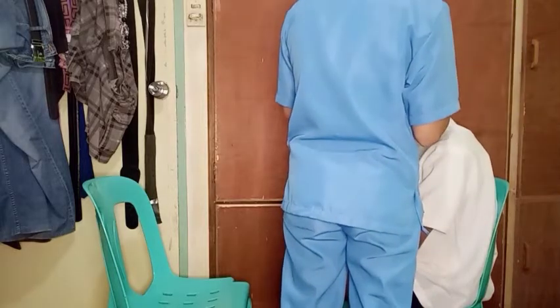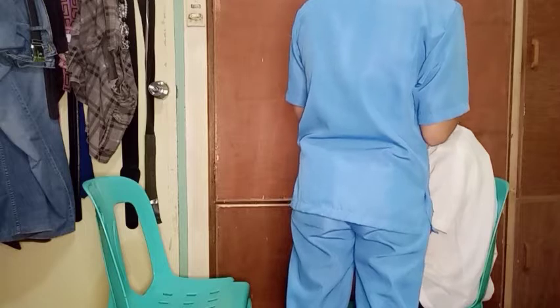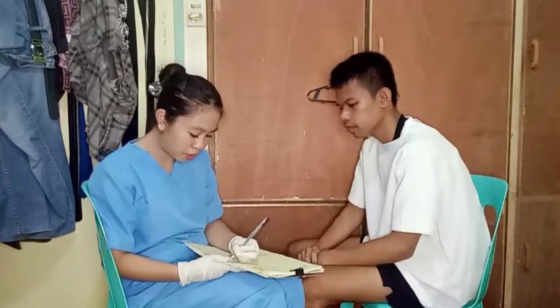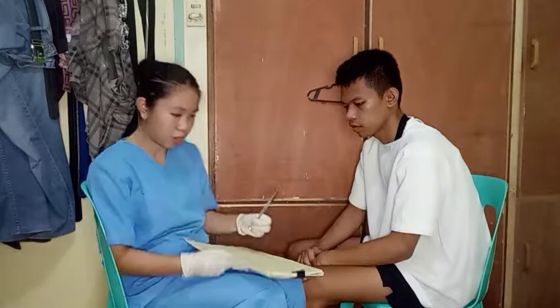Stop. Okay, sir. Stop. Okay, sir. Sir, so it looks like your time intervals are more than a minute. Okay, so I will take note of that. Okay, so into the other ear, sir. Okay.